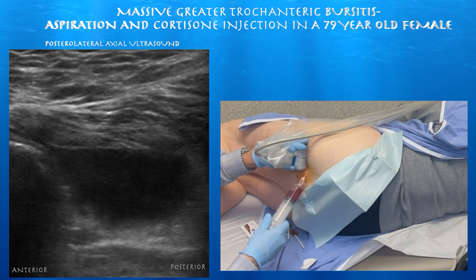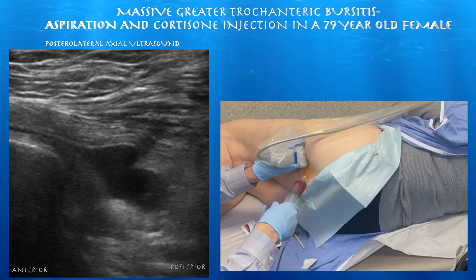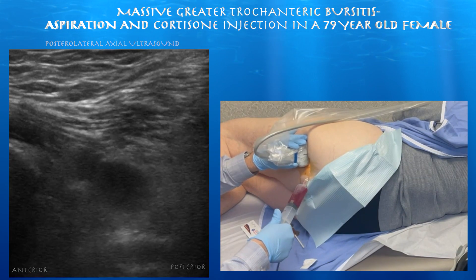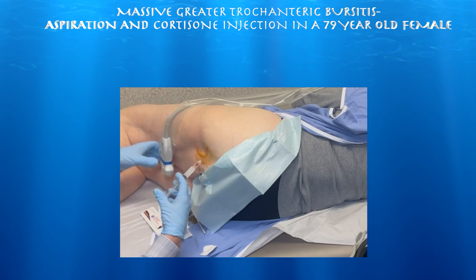Here towards the end of the procedure, we drained about 40 cc's total of serosanguinous fluid, and then there was some residual fluid left which we could not drain. There may have been some debris that got into the needle and was blocking it. But we did get most of it out, and then we went ahead and did a cortisone injection into the bursa.